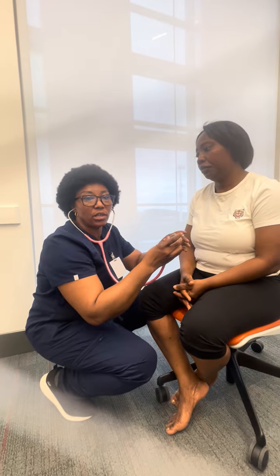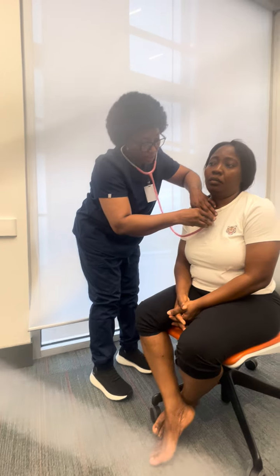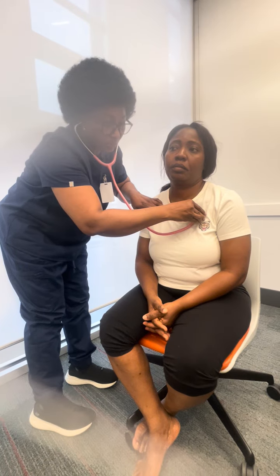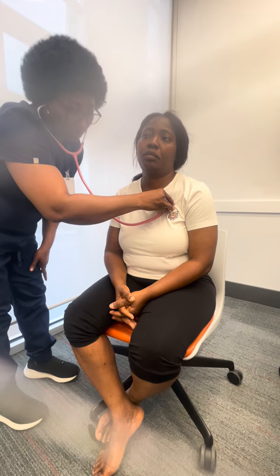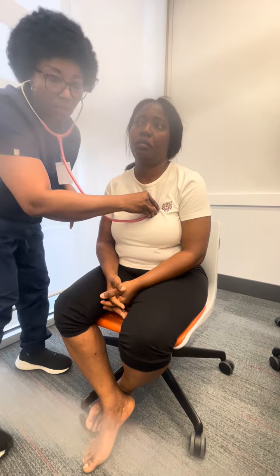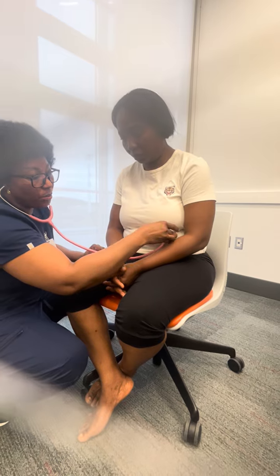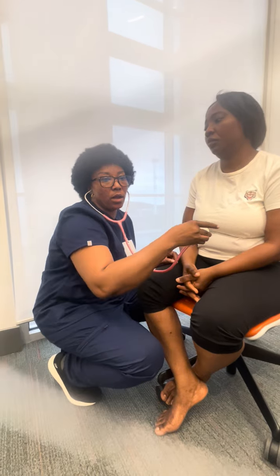Now I'm going to check for extra heart sound using the bell side of the stethoscope. First, I'm going to look at the landmark of Louis, second intercostal space, right sternal border. That's the aortic. Now I'm going to move to the pulmonic, which is the opposite side, second intercostal space, left sternal border. Now I'm going to move to the Erb's point, third intercostal space. Now the fourth intercostal space, which is the tricuspid. And the fifth intercostal space, which is the mitral. Okay, there are no S3 and S4, and there are no murmurs.